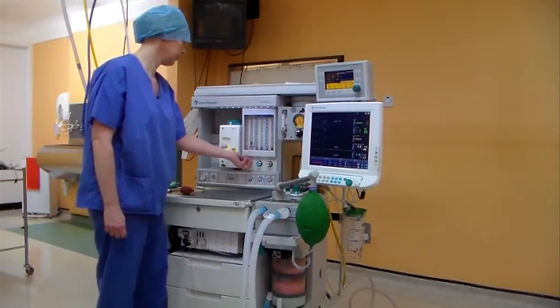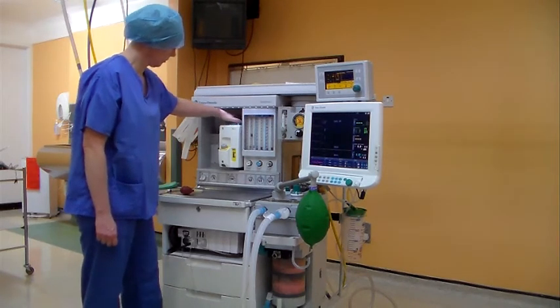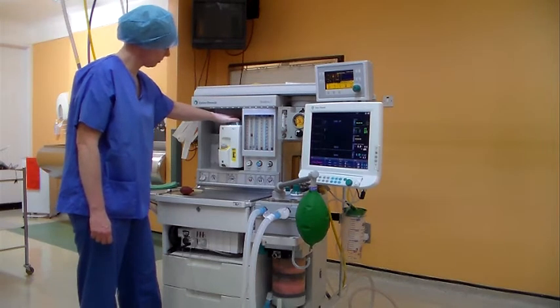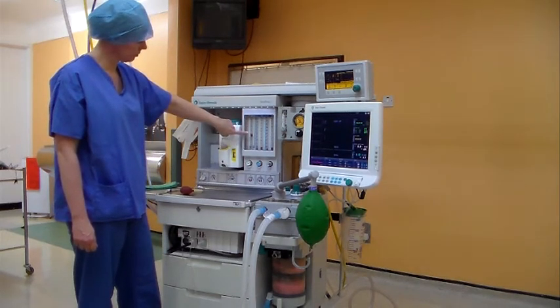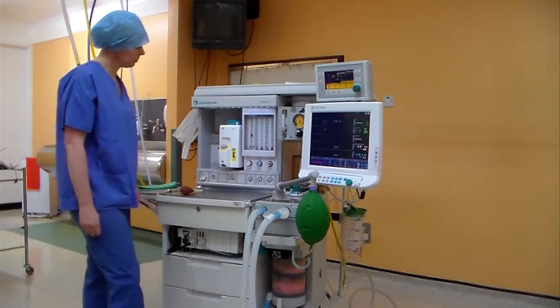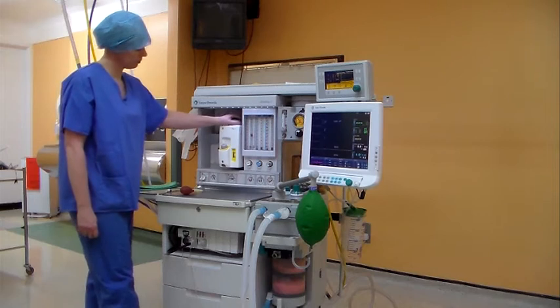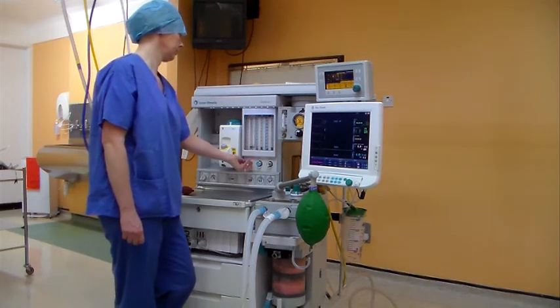Vaporizer back pressure. Turn the oxygen to 6 litres and turn on each vaporizer to 1%. The oxygen should not drop by more than 1 litre and should return to the same height in the flow tube. If the flow meter does drop by more than 1 litre, replace that vaporizer. Ensure all flow meters are returned to the minimum position.